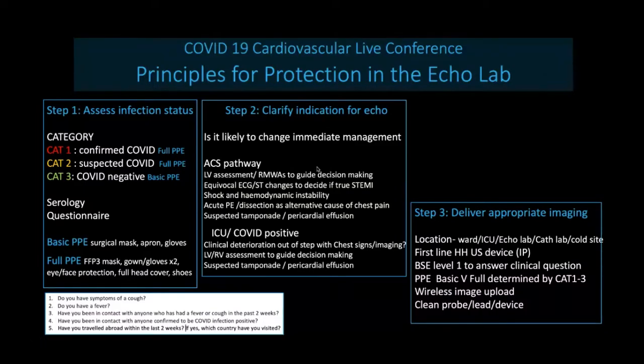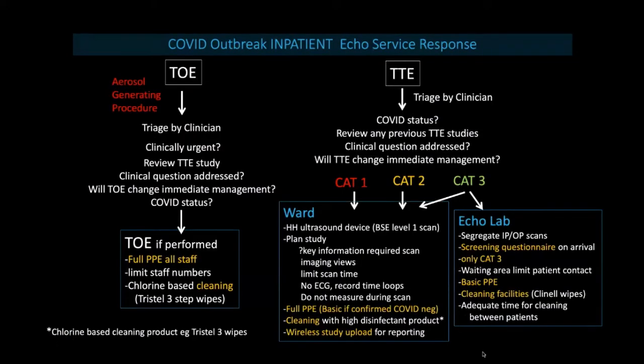And then step 3 would be delivering the imaging, and really that's built around the personnel, it's built around the location, and then also the devices that we'll use to image with. And I've listed them here, but I'm just going to highlight a few steps. So time is short, but what I thought was, because this is being recorded, you'll have these slides and you can read the detail of this at your leisure. But what I've set out here in this slide and the next slide is really our inpatient approach to our response to this COVID outbreak and our outpatient approach.